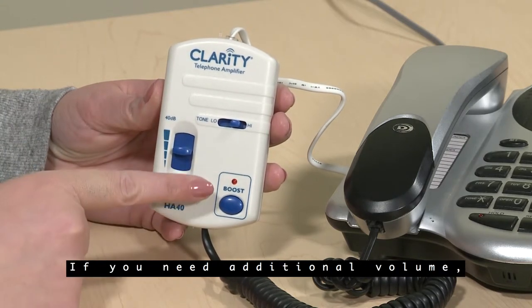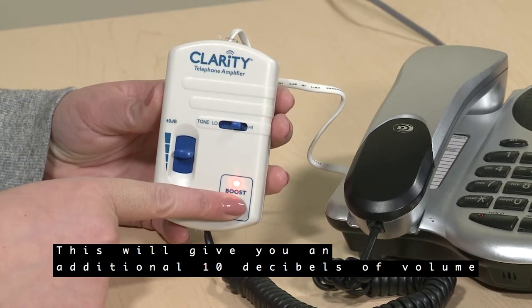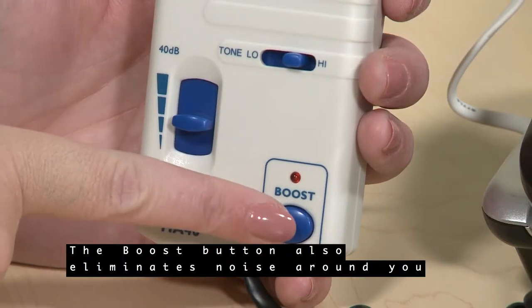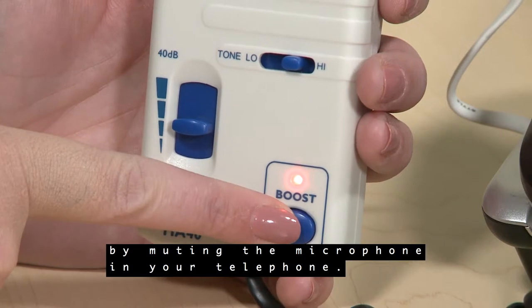If you need additional volume, you can press the boost button. This will give you an additional 10 decibels of volume for the voice you are receiving. The boost button also eliminates noise around you by muting the microphone in your telephone.